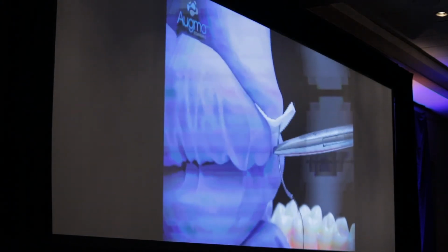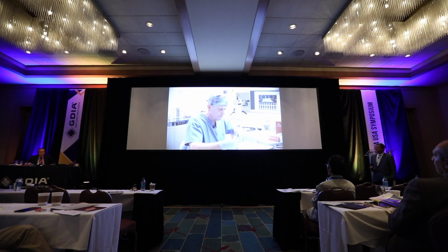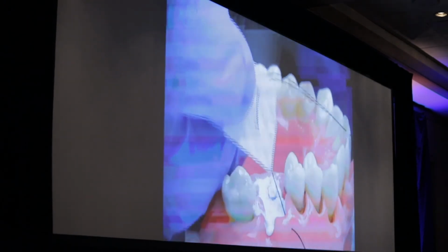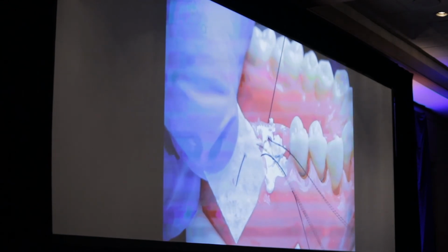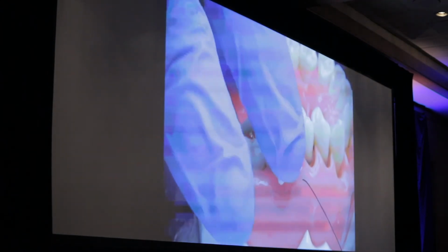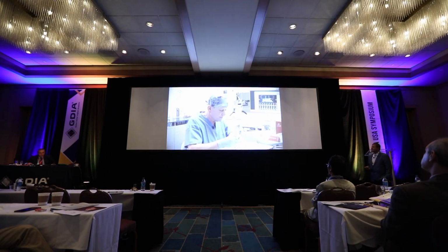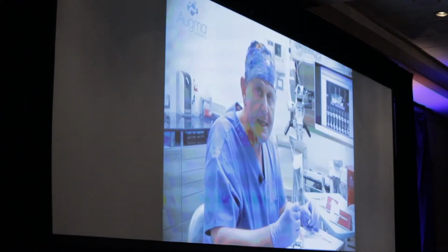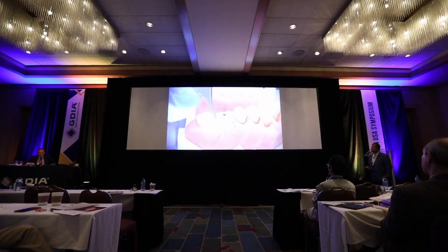insert it to the bottom of the collagen sponge, and from up to down, insert the needle into the lingual aspect, and place the sponge above the grafted site and make your first suture to stabilize the collagen sponge in place. Now remember that the collagen sponge must be stabilized together with the soft tissue by its first knot. After stabilizing the collagen sponge, or the membrane, in place, you continue with a crisscross suturing in order to protect it in a better way.